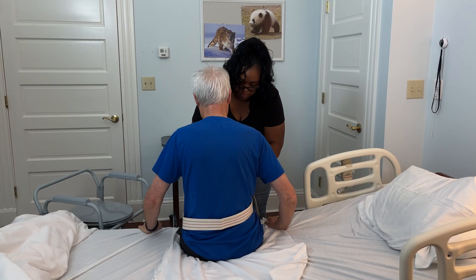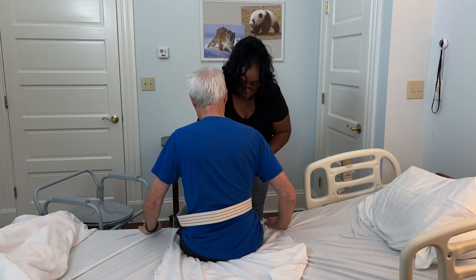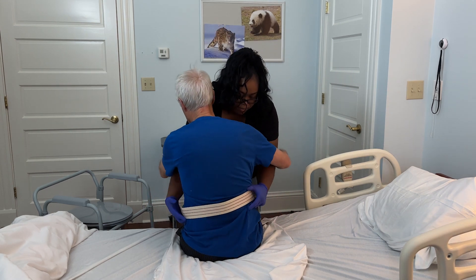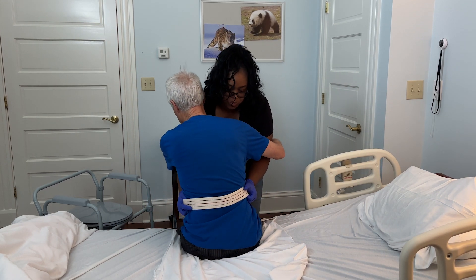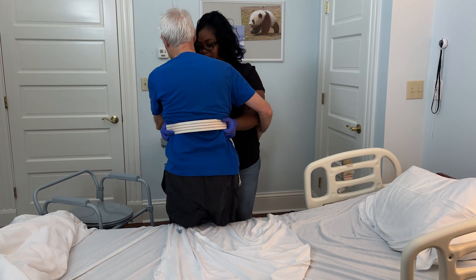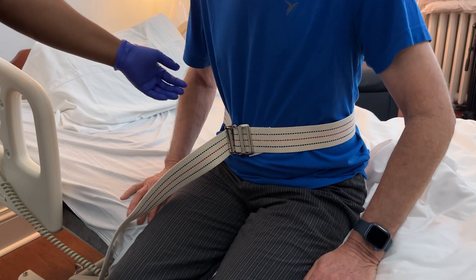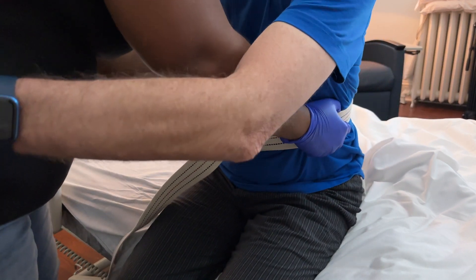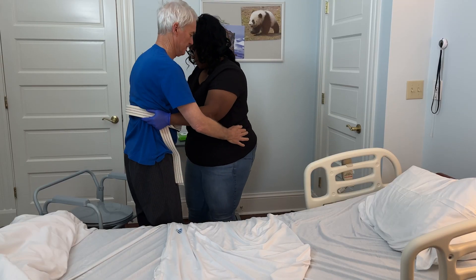Assist your loved one to stand, using the gait belt for support. Do not allow your loved one to wrap their arms around your neck — this will cause them to tug on you and could injure you. Instead, have them use their arms to press themselves off the bed. If they want, they can place their hands on your hips.